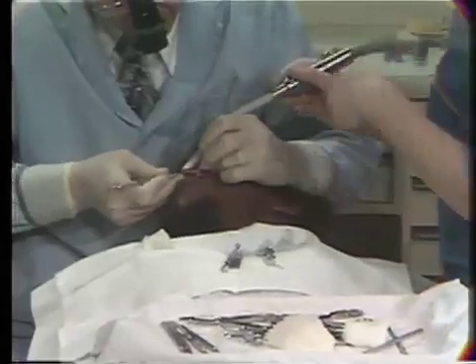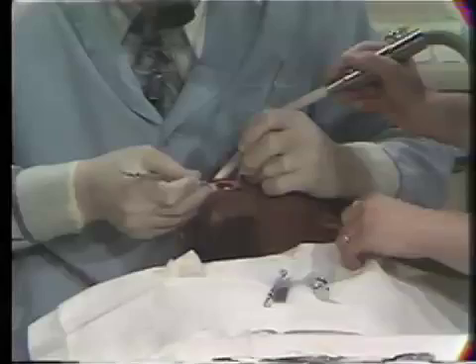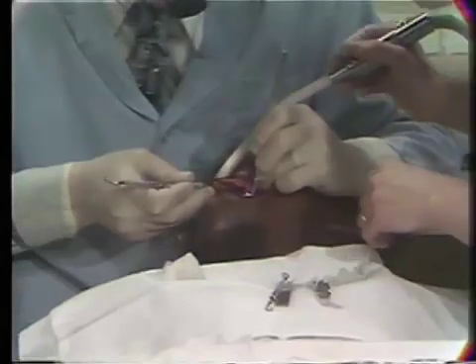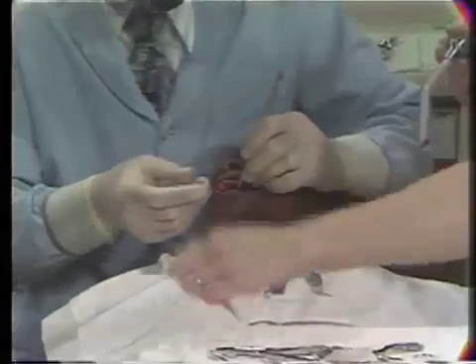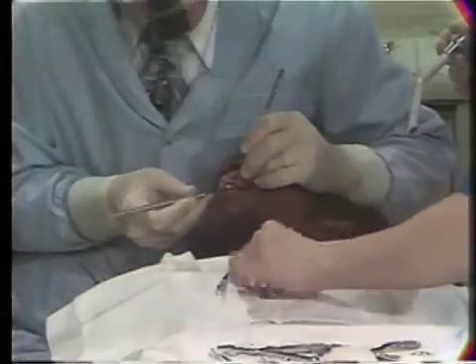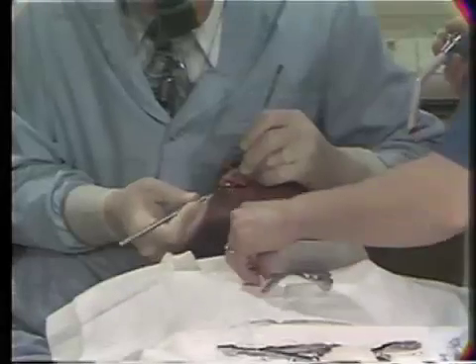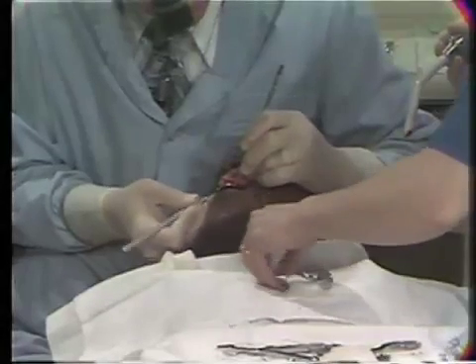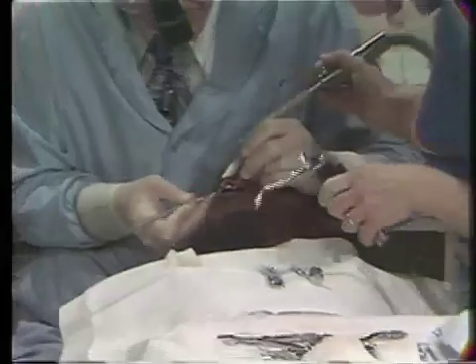And I believe that there has to be some balance in the judgment one uses. Scaler. When making a decision as to how much assistance he's actually going to use during the various dental procedures that he'll be performing in his office. Go ahead and rinse with this. That way a little bit.